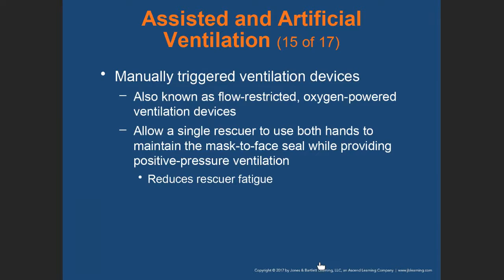Now, the manual triggered ventilation device, not common in EMS, so I'm not going to put a lot of emphasis on this. You're not going to see it a lot in BLS response. You tend to see it more in the hospital setting and critical transport. When we start to talk about critical transport paramedics and stuff like that, that's where you're going to see these devices.